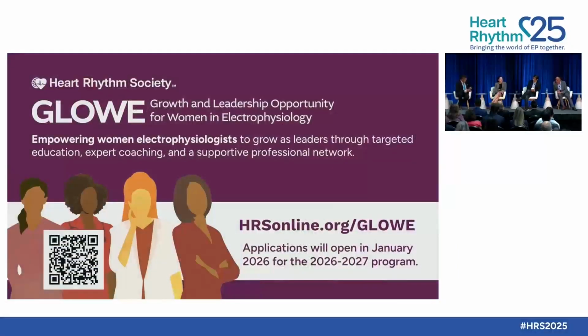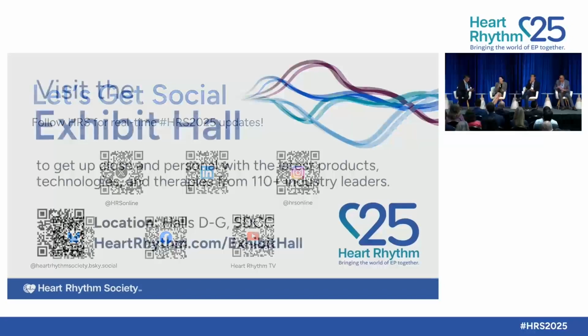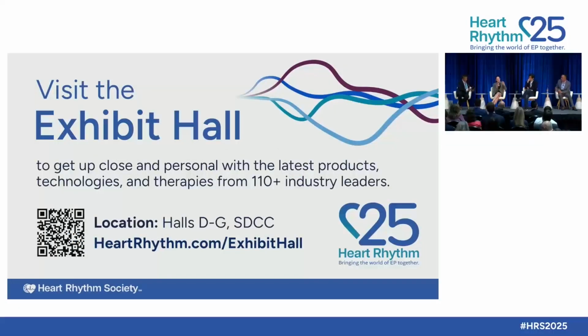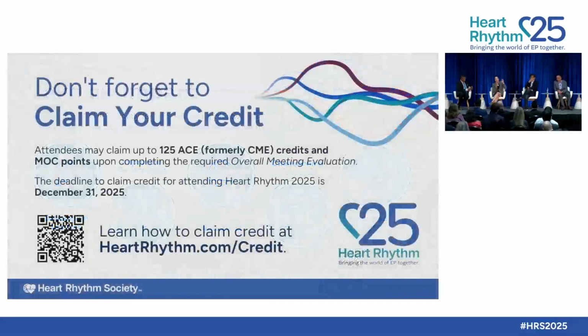And then let me ask you this question, Tina. The question is, ablation itself can create more substrate for AFib to recur. Can you comment on how Volta mitigates that? Or maybe the question is, how do you mitigate the atrial tachycardias after? I think there are some elegant basic science studies on it. Imagine you have a very small focus of scar, and imagine you have something anchored to that that's spinning around. If you just do one ablation lesion there, it becomes a slower cycle length local circuit, and hence, in my head, that's the mechanism of the atrial tachycardias that can happen, that are relatively micro reentrants still in a slower cycle length.